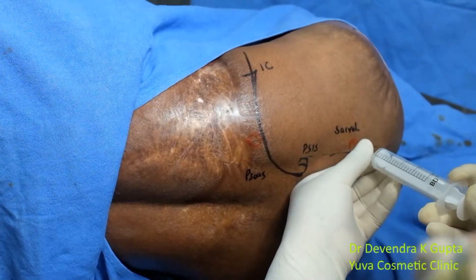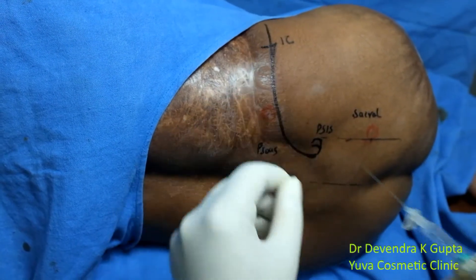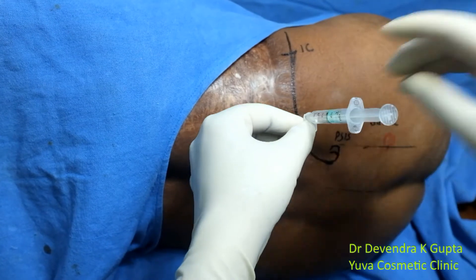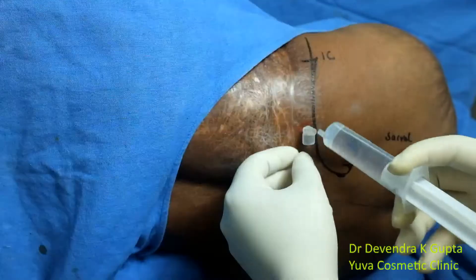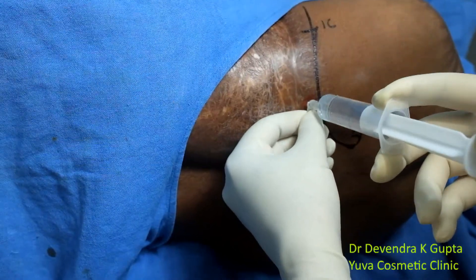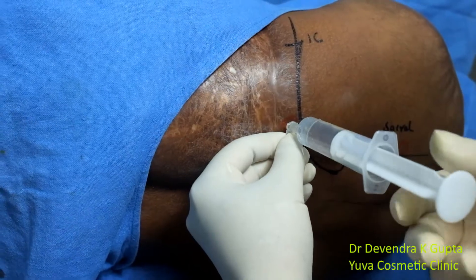The sacral plexus block is now complete. You can see there is regurgitation of fluid. I am now palpating the top of the iliac crest, and this point is taken in between the posterior superior iliac spine and iliac crest. The needle is inserted; I have taken 20 ml of solution. The whole needle in this patient has gone inside to about 7.5 centimeters in depth, and there is free flow of fluid.